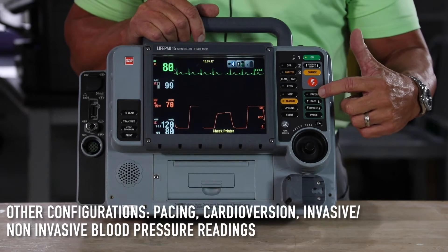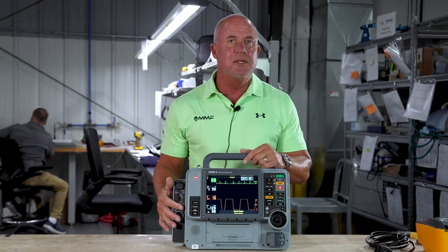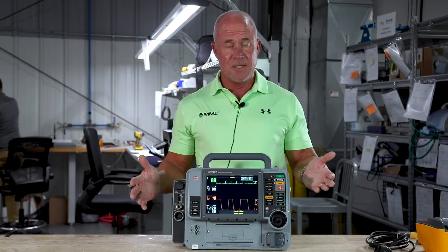Of course, non-invasive blood pressure or invasive blood pressure, 12-lead capability, and a way to manage your data or your call run on the back end.